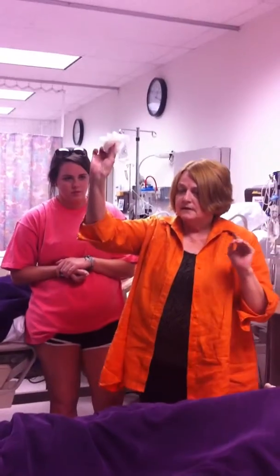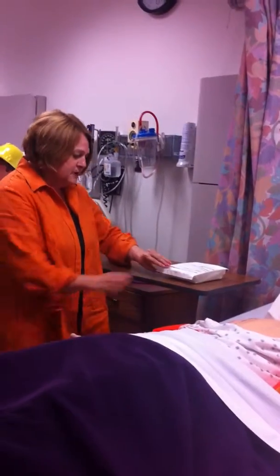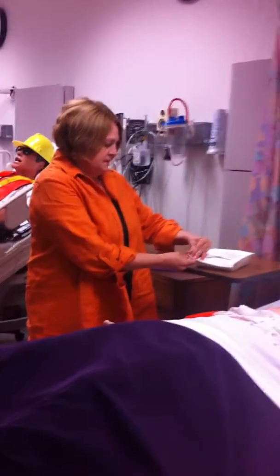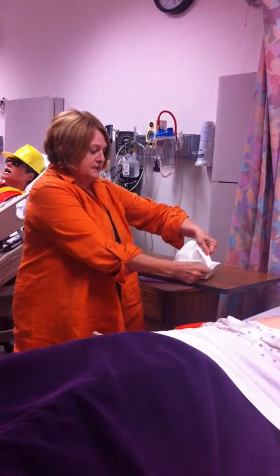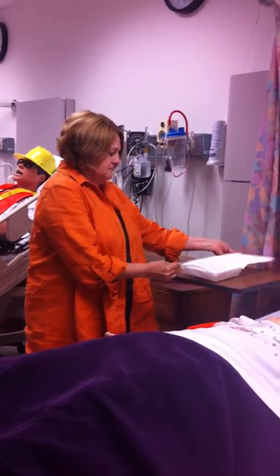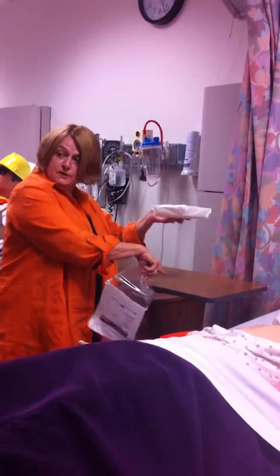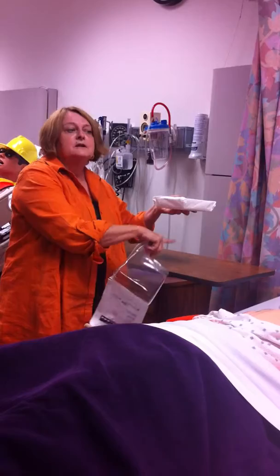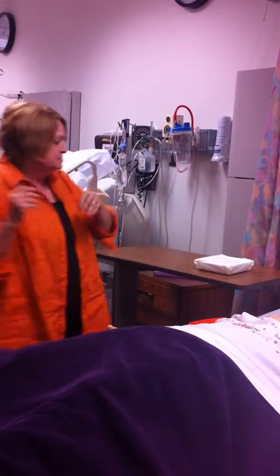Okay. And don't forget, always practice Diva Drop. If you don't use the Diva Drop, you're going to break sterile technique. So remember your Diva Drop. Okay. When you open a sterile container, you're going to open it away from you, because you don't want any of your scruff from your skin, from your arms, to fall into your sterile container. Okay, now I'm going to take this out. I can touch this, right? Because it's getting ready to go onto a non-sterile surface. Non-sterile touching sterile makes sterile non-sterile, right? And if Diva doesn't drop well, you just leave it there.